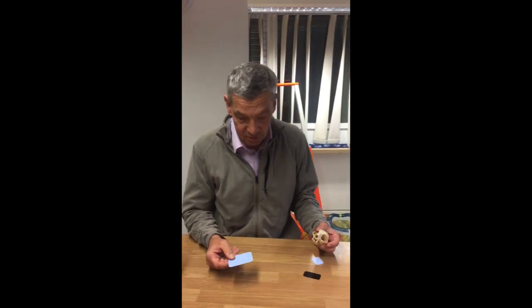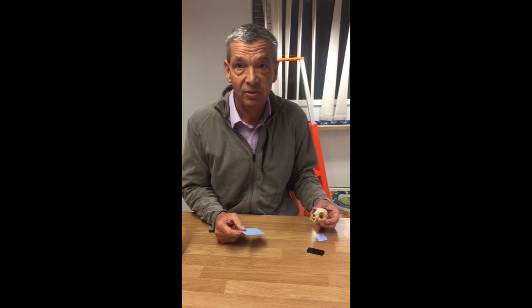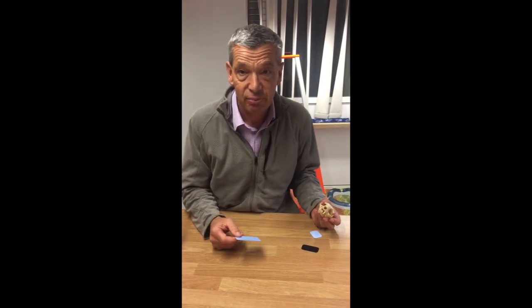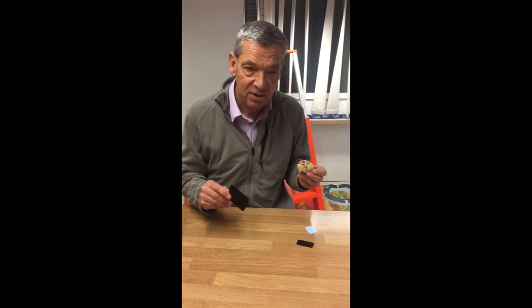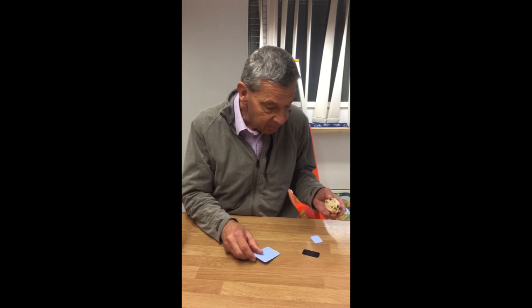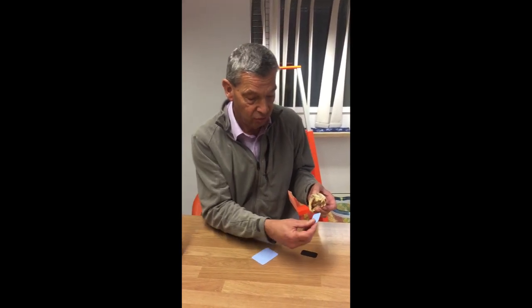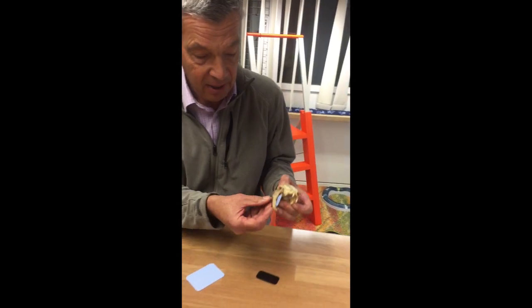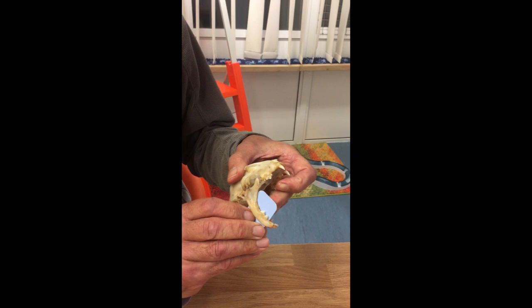So, okay, just want to discuss dental x-rays in the cat, particularly the bisecting angle technique. And it's all actually pretty easy. Don't get too bogged down with all these angles. There's a lot easier way than doing that. Simplest view is what we call the intraoral parallel view. Intraoral because the plate goes in the mouth, parallel because it goes parallel to the axis of the tooth.